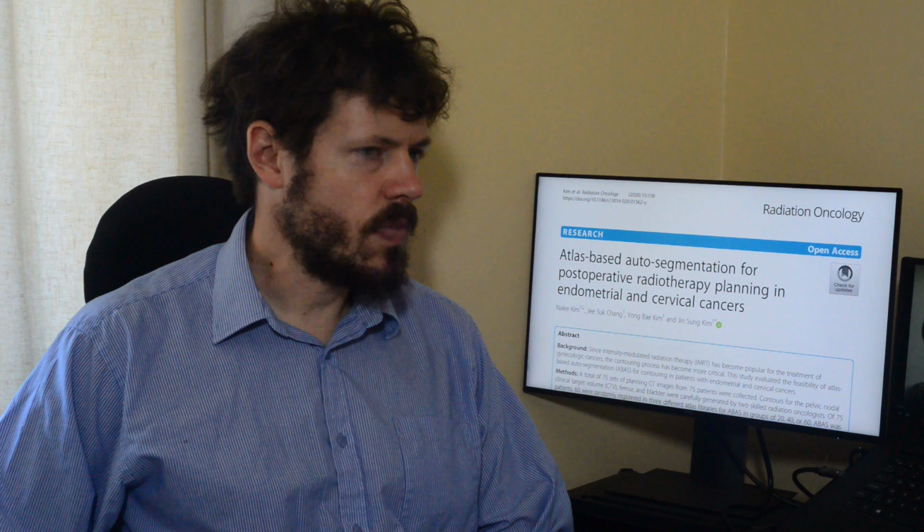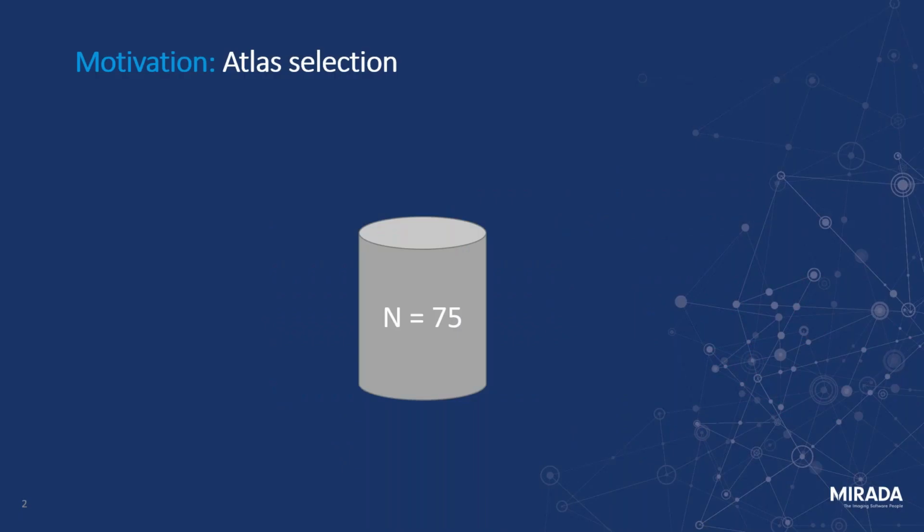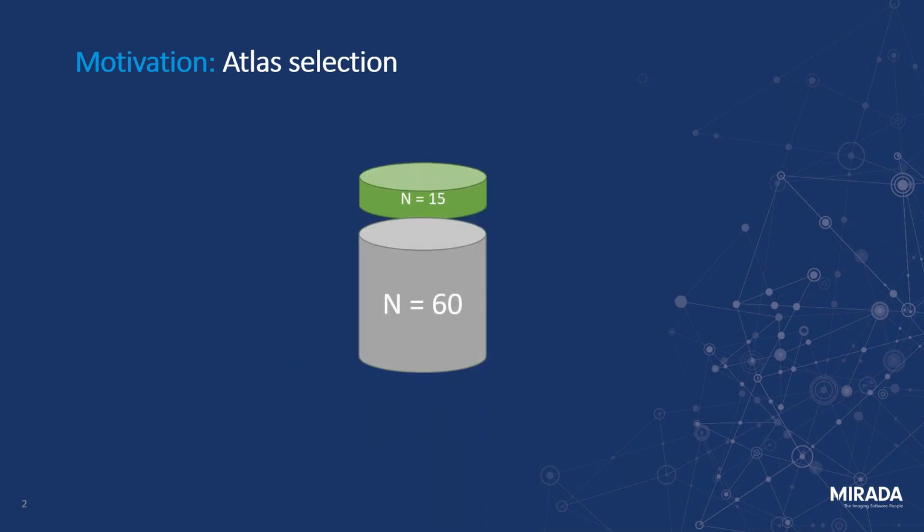In this study, the authors wish to establish what the impact of increasing the database size for Atlas-based contouring had in clinical practice. To do this, they collected a database of 75 contoured cases to use as atlases and test cases. From the 75, they extracted 15 cases to use as their test set.